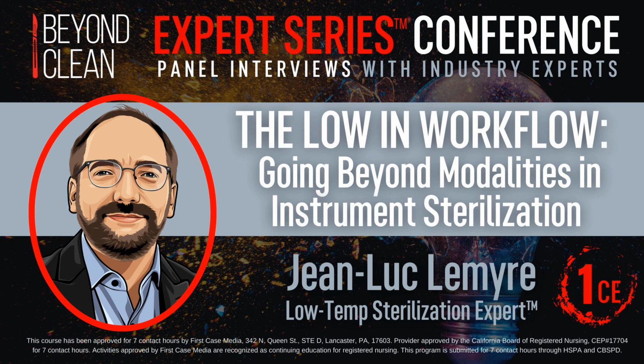That very well may be the case, but it is worth that extra step of investigation to reach out to that instrument manufacturer or to the sterilization modalities that you do have and see if anybody has conducted a validation study with that instrument. Because depending on how old the system is, it may not be written in that IFU. So that's a great call out, Jean-Luc, and I think that's really helpful for our listeners.